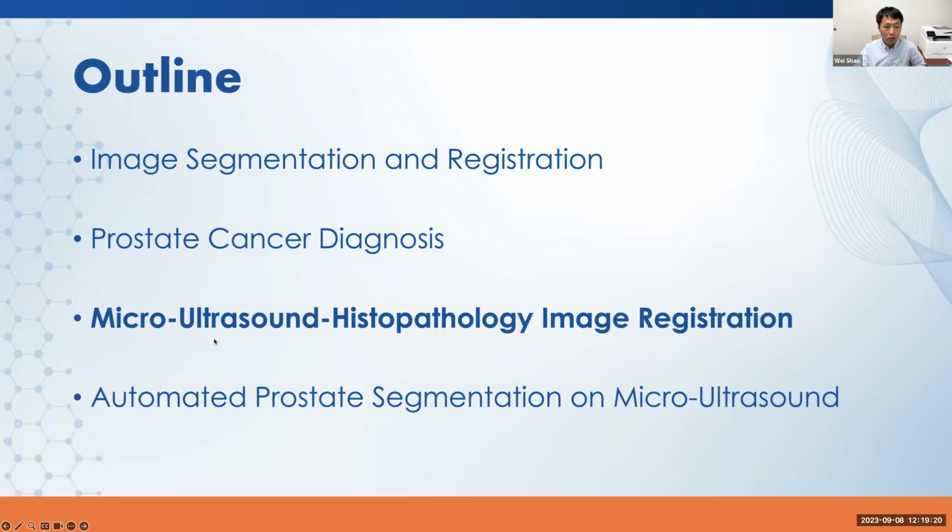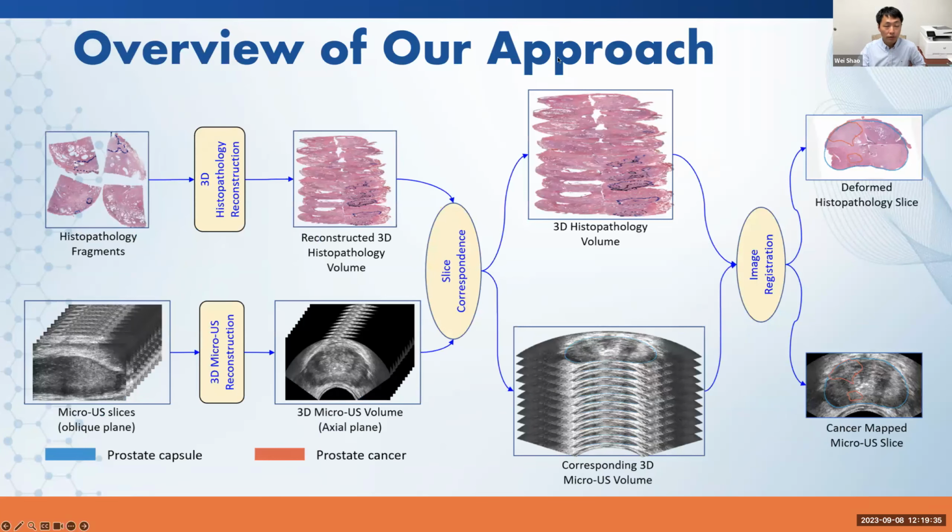And for us, we're interested in doing registration of micro-ultrasound and histopathology images. And this is actually the first pipeline developed in the literature to do such a registration. So this figure gives you an overview of our approach.